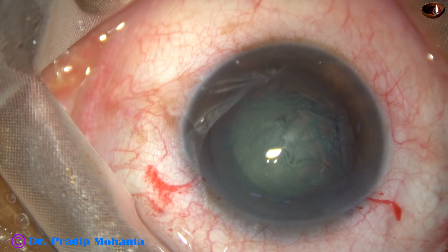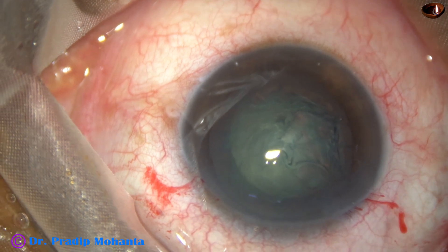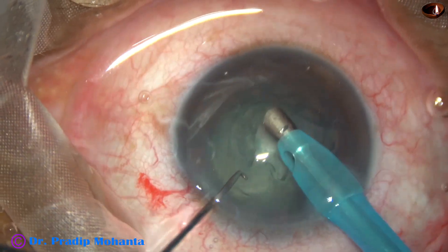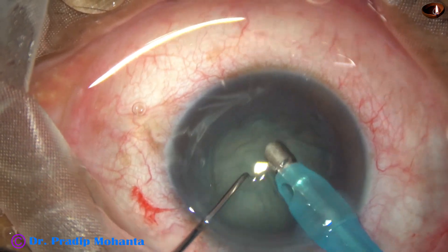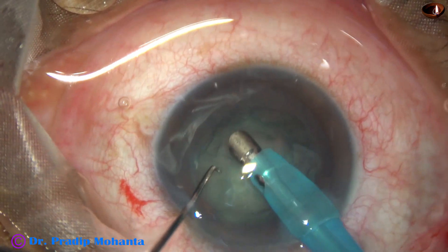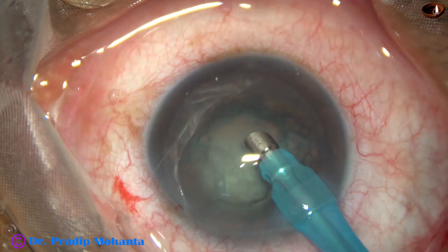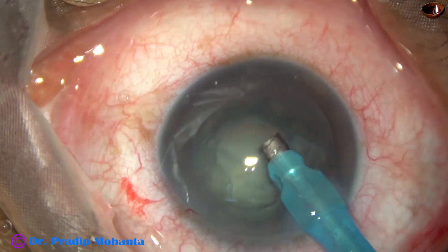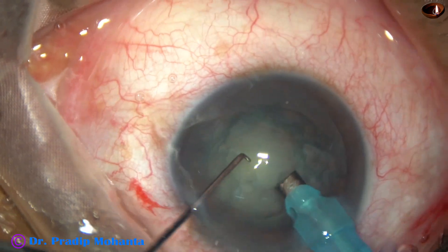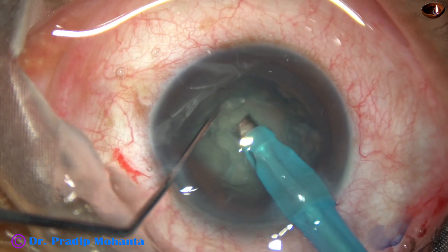The phaco needle goes in with its bevel down. Some superficial cortical lens matter is aspirated — vacuum at this time is about 200. Now the handpiece is turned to make the bevel up and we are going to make a trench. Vacuum at this time is about 80 to 100 mmHg.